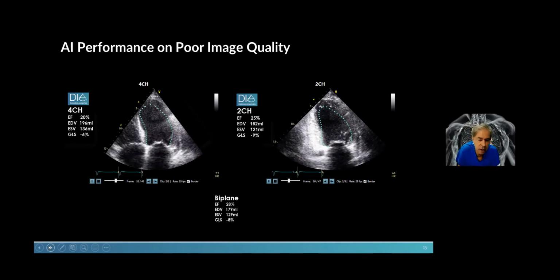And just as quick as you saw in this example, where the endocardial borders are not well seen, it's providing ejection fraction as well as longitudinal strain. So I think a very nice example of salvaging technically difficult echocardiograms to increase the yield of readable, translatable into clinical management solutions.